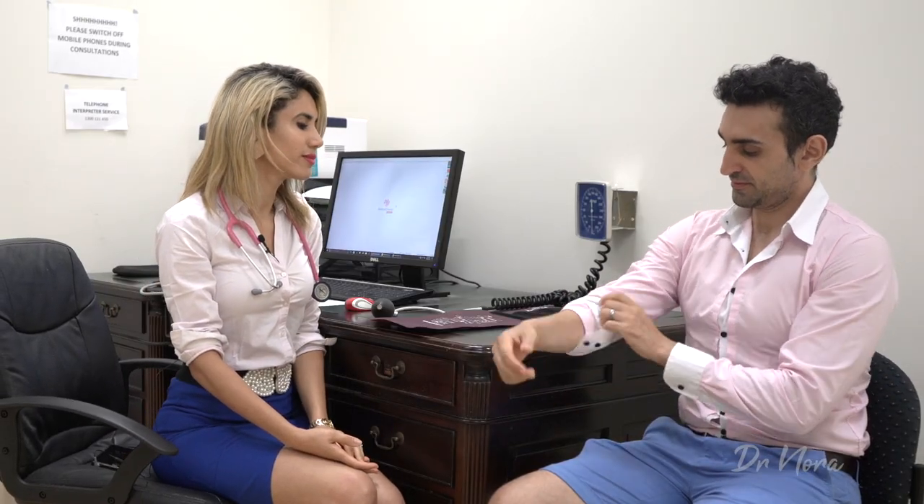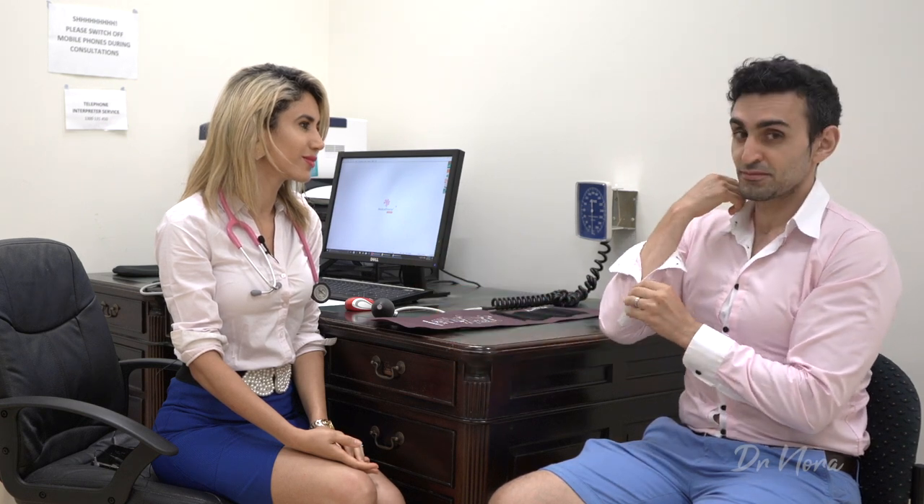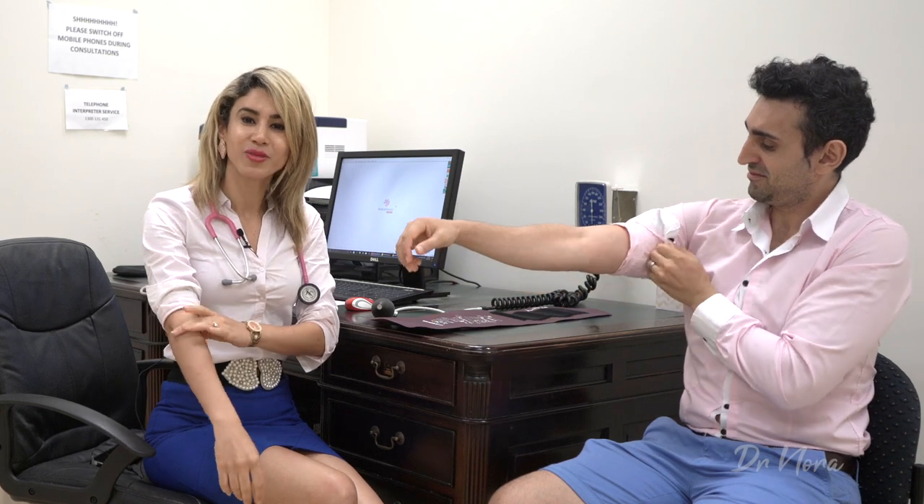Next up, we need to ask the patient to expose their upper arm. Sometimes patients may not always be wearing the most appropriate clothing — you may be able to slip their arm out of their shirt or just undress them slightly. Make sure that your patient is nice and comfortable and has rested for a little while — not too tense or anxious — and always ensure that their feet aren't crossed, because crossing their legs will give a higher blood pressure reading.